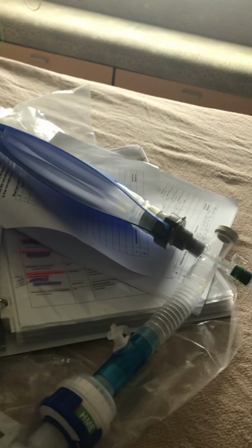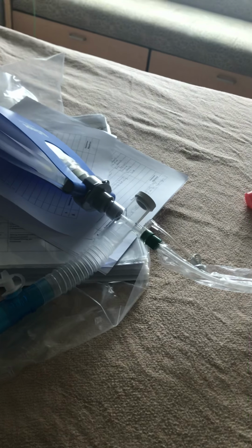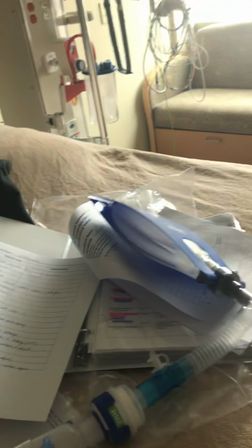While we're pulling that out, we are able to see what color sputum is coming up, clear, yellow, whatever color that may be. It's not liking that, so we can document that. We will do a patient assessment, listen to breath and lung sounds, see if they've improved or worsened. Let's say they're still sounding pretty coarse. Doctor orders a duo-neb treatment. After verifying the doctor's order and the patient, we use a mesh inline neb.